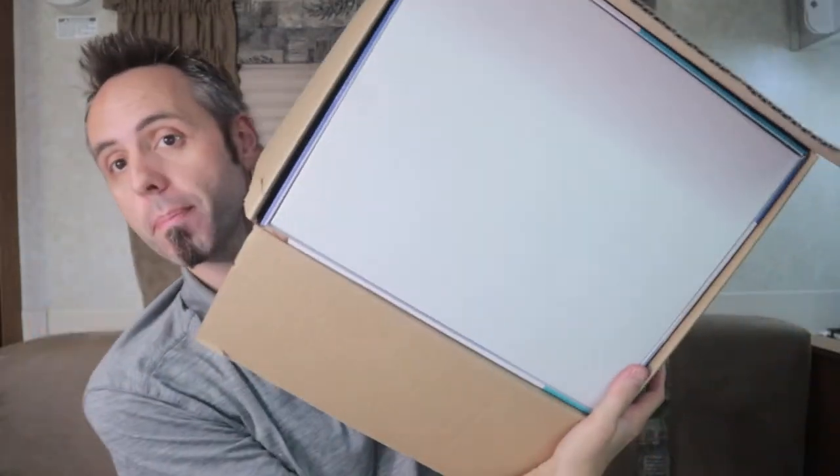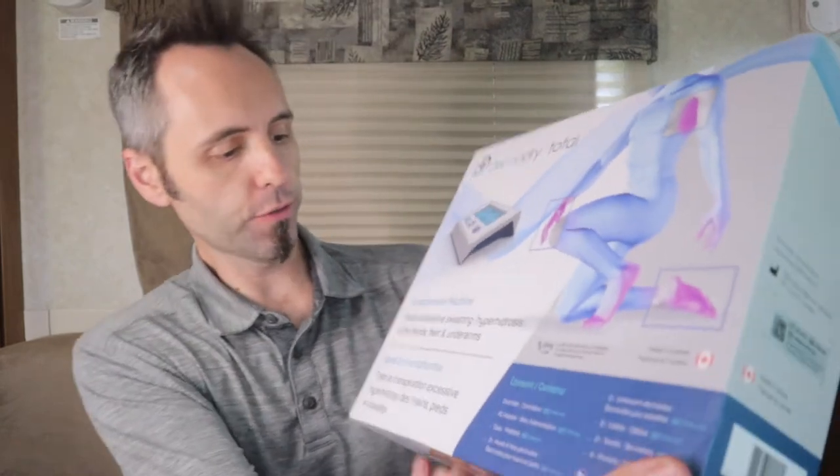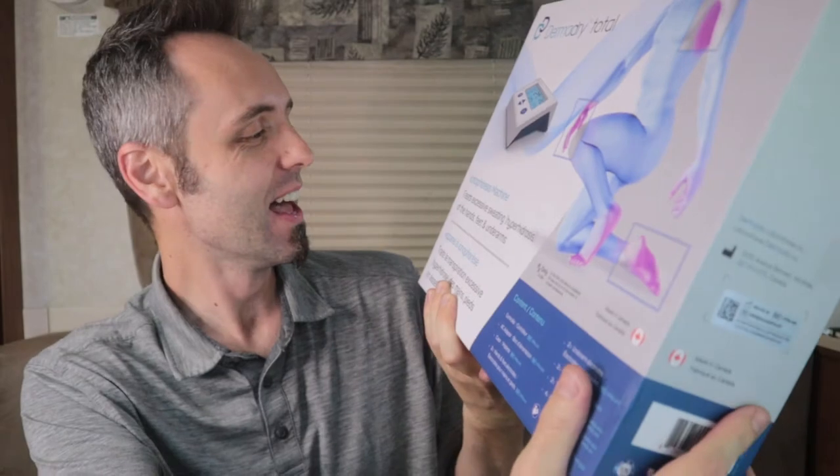Let's get into this and see exactly what they sent. From what I understand, it's the total package — there are two or three different types of packages you can get depending on where you sweat the most, and the total one covers the whole body. So let's open this up. First, just a white box. Inside there's a card: 'Dear Lane, thank you for choosing and trusting Dermadry to treat your excessive sweating. We are honored to become part of your journey to the dryness you deserve. Please keep in mind it can take a few sessions before noticing a difference.' It's made by a company called Dermadry — the Dermadry Total — made in Canada. It's an iontophoresis machine that treats excessive sweating and hyperhidrosis of the hands, feet, and underarms.